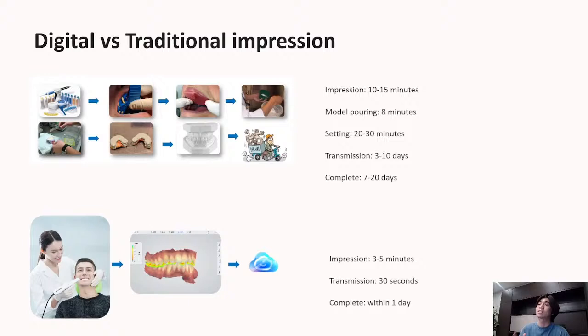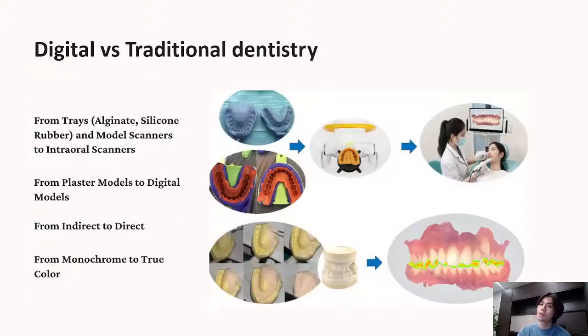If you use an intraoral scanner, it captures highly detailed digital impressions of the patient's teeth and oral structures. It's not invasive, it's very comfortable, and it's fast and efficient. Here is another detailed comparison.